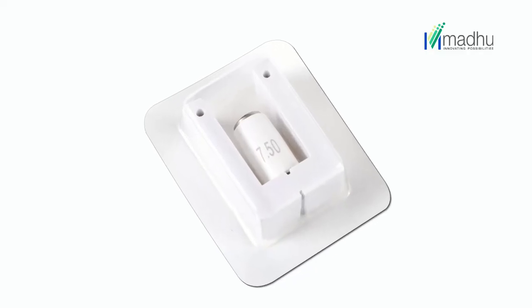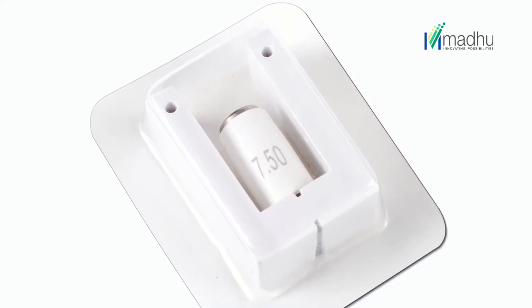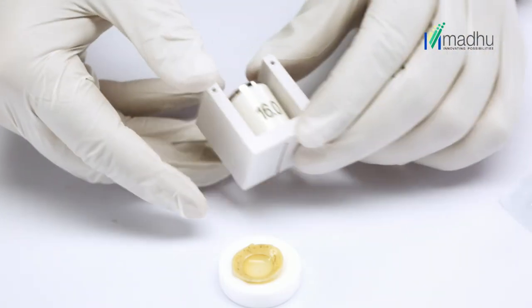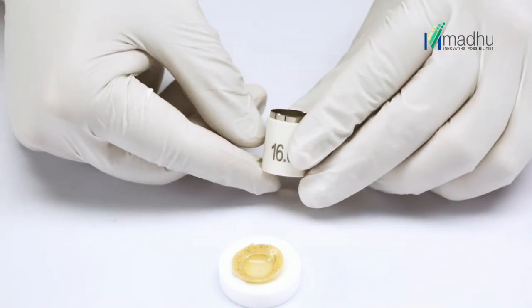Disposable trephines are ETO sterilized and supplied in sterile blister packs of one trephine each. Open the blister and take out the trephine from the spring-mounted protective stand. Now place the donor cornea in the well of the teflon block with the endothelial surface up.